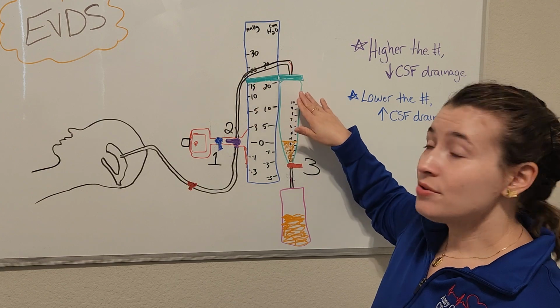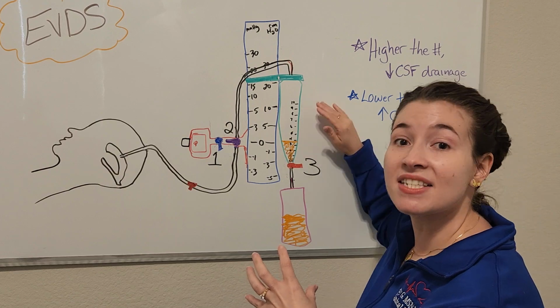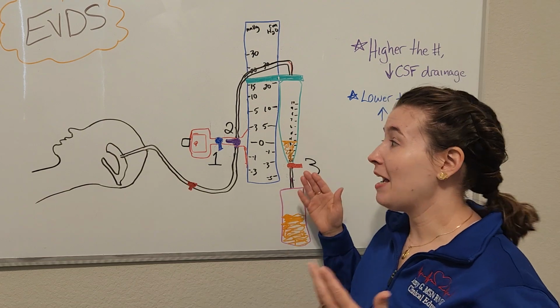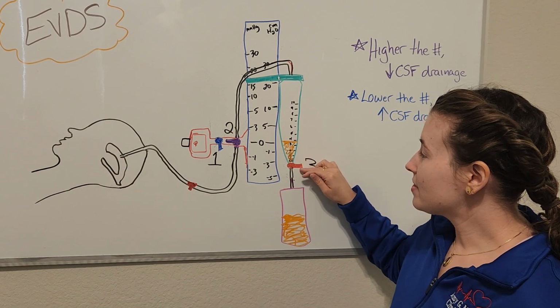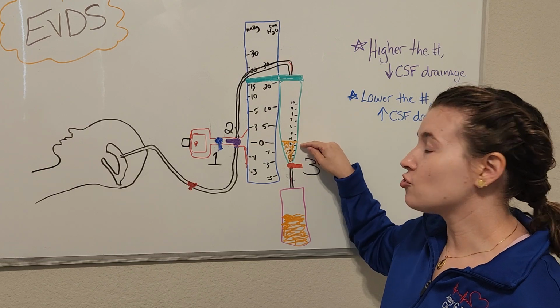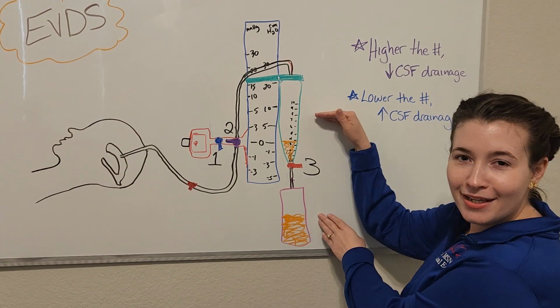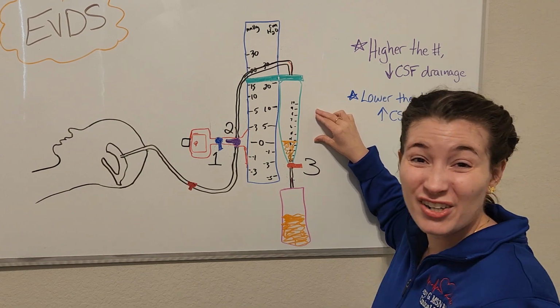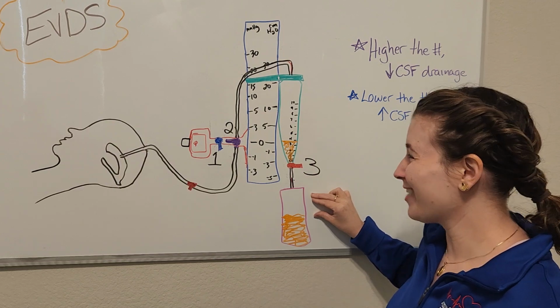That tubing then goes to the buretrol, or the actual collection chamber of the EVD, where that CSF is going to lie. Now, again, depending on your orders, we'll typically be emptying this buretrol every hour, okay? And then this stopcock over here, stopcock number 3, is the one that we're going to be manipulating to drain the CSF from the buretrol into the bag. I like to think of this section as kind of like a Foley catheter. The buretrol is very similar to the urometer that you can dump into the Foley bag, right?